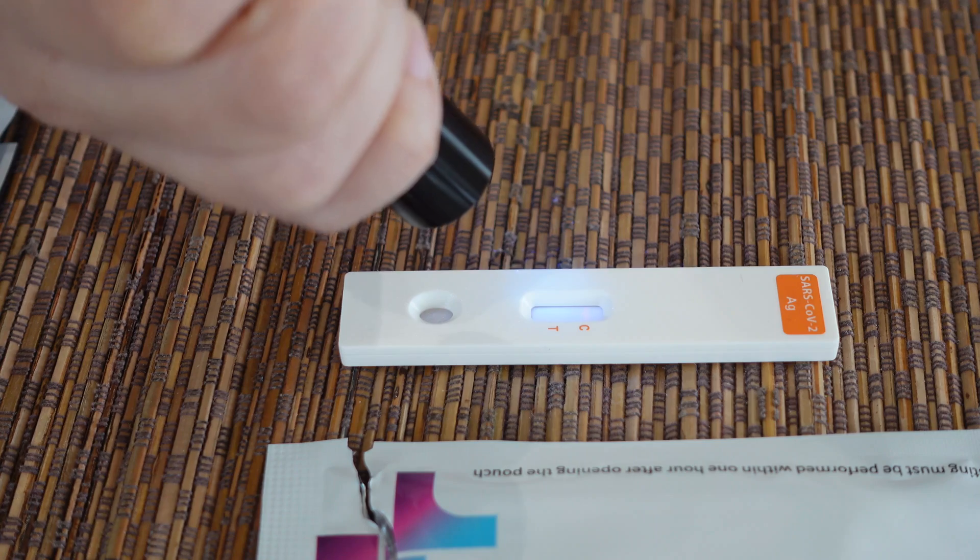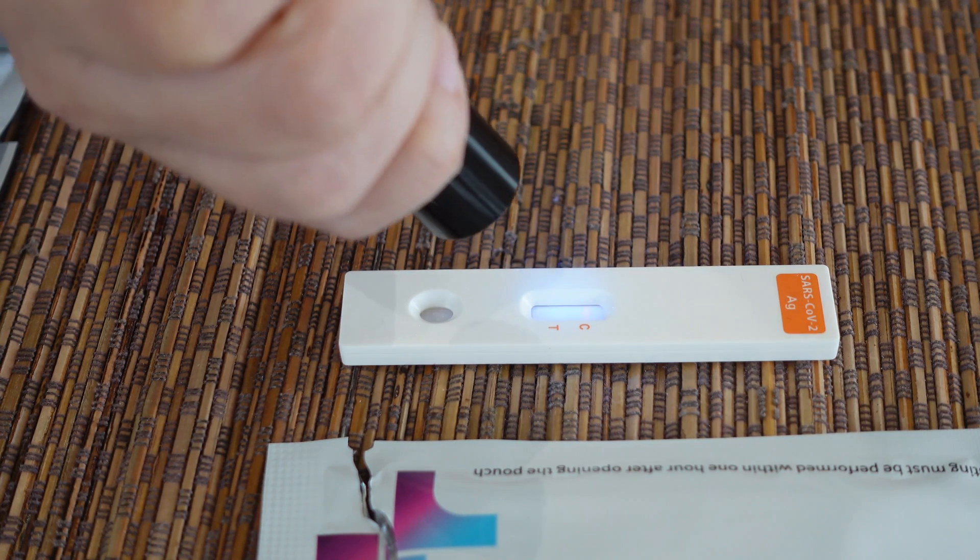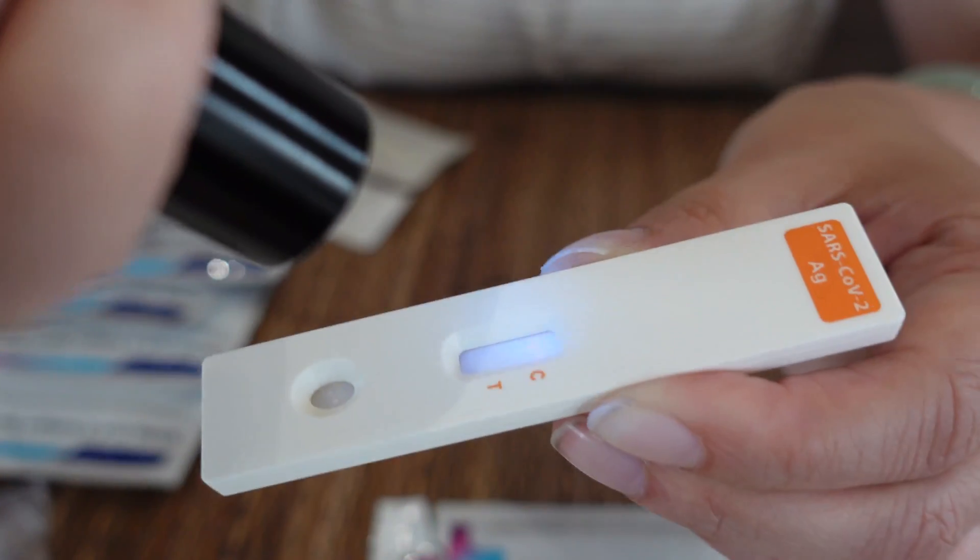So the result is one line, so it's negative for Felicia. So guys, we got our result — it's negative! Yay!